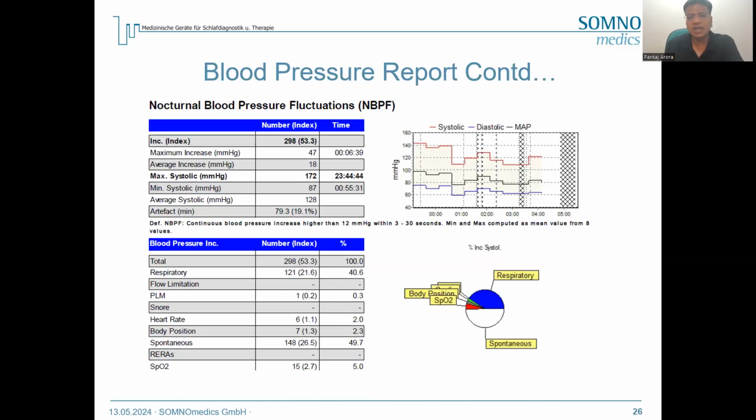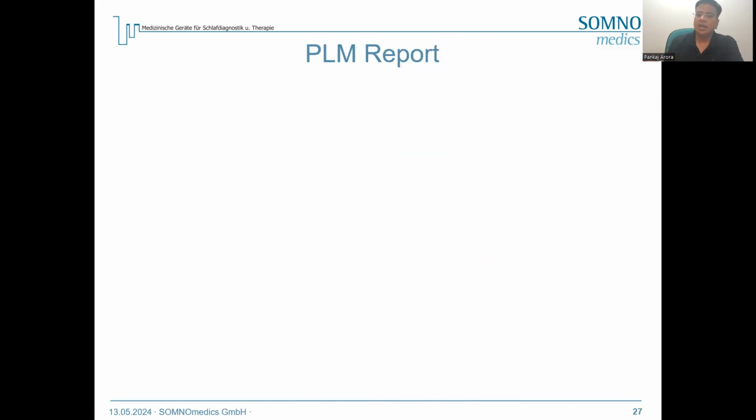Now the patient has come to you and the patient is not sleeping well, or is feeling lethargic and tired during the day. As a sleep clinician, we obviously look into the history and the questionnaires, but once we do the sleep study, we also put on the leg movement sensors. We do not know why sleep is fragmented. We still have not documented it. It was just a subjective measure that he was not sleeping.